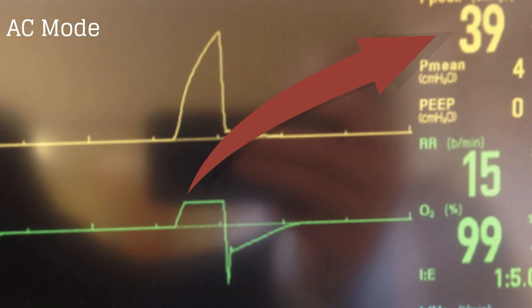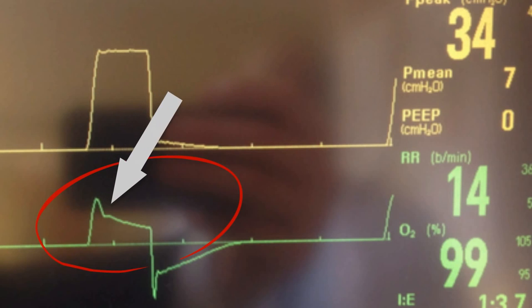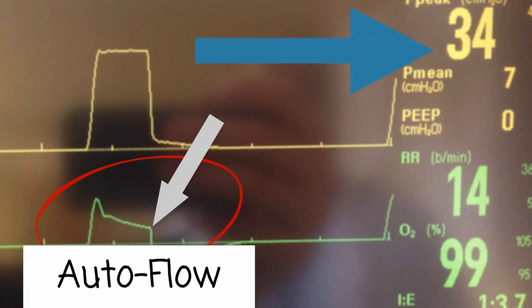Normally, this type of fast, constant inhalation creates a higher PIP than in the PRVC mode. But in PRVC, the waveform looks like this. That means that when a patient begins inhalation, they start fast, but their speed decreases as they inhale. This is actually more comfortable and it produces a much lower PIP. And the flow is automatically set and adjusted by the ventilator, not the respiratory therapist.